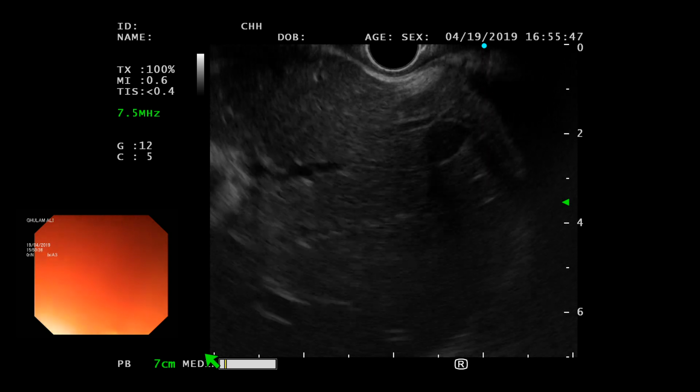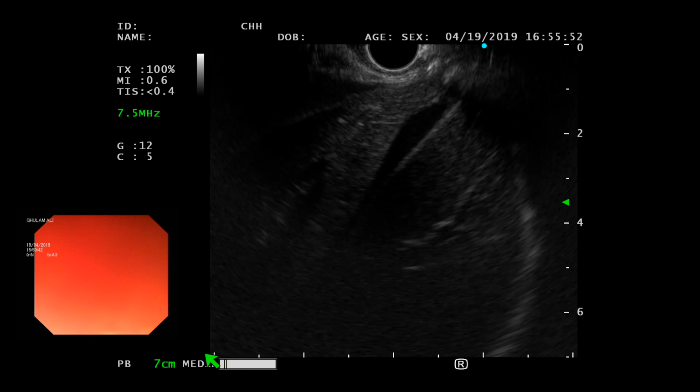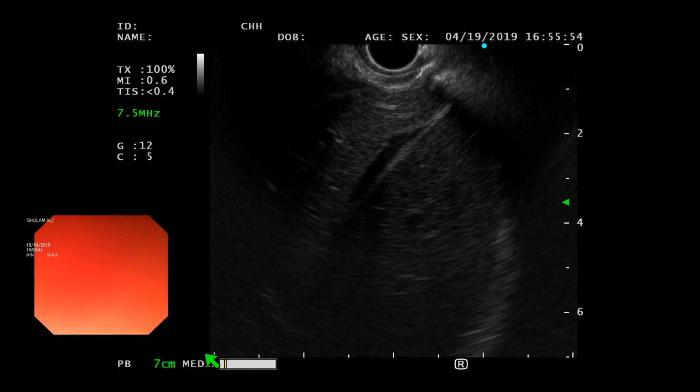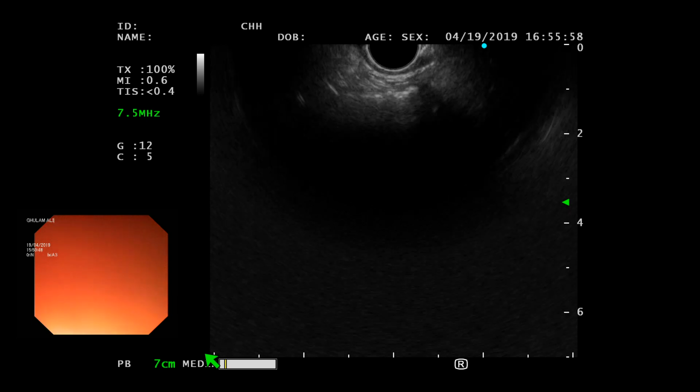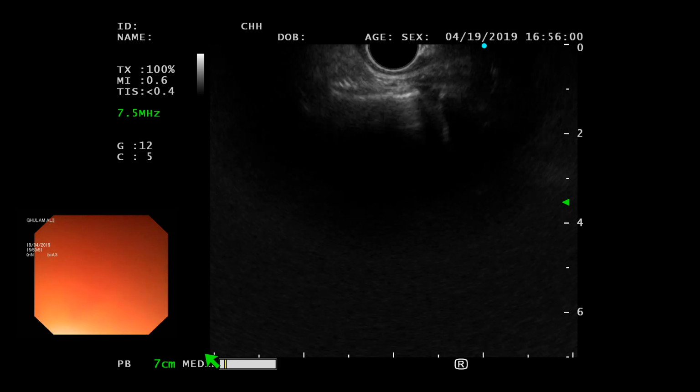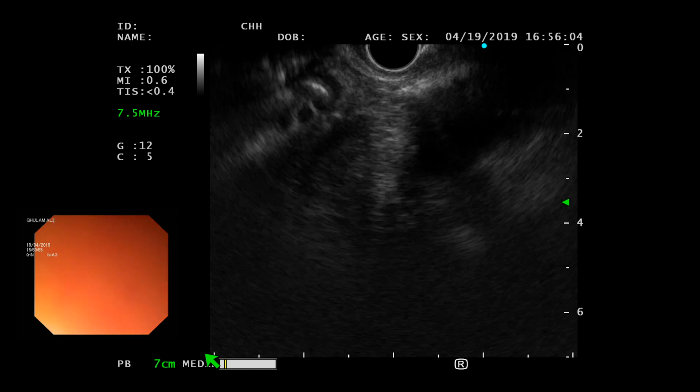हाँ, ठीक है. जितनी देर में स्कोप स्ट्रेट होगी, हाँ, चलते जाए, ठीक. IVC, चलते जाए. तो और big wheel towards you a little bit and keep going, keep going, keep going. There you go. ठीक है.